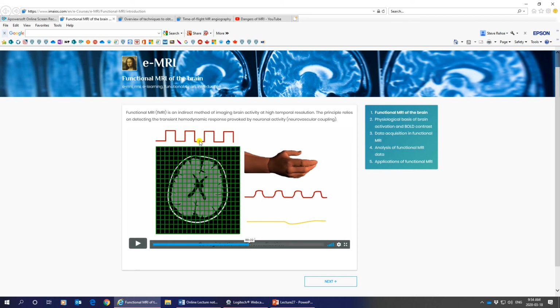It can be think about your favorite song. Think about a cat. Think about your favorite song. Think about a cat. It just has to be something where you do it over and over and we know what the pattern is. And then we look at the data coming out of your brain, which is noisy, but we superimpose it with the periodicity that we know is happening, that we asked you to do.